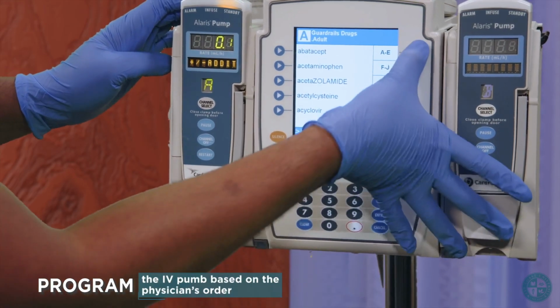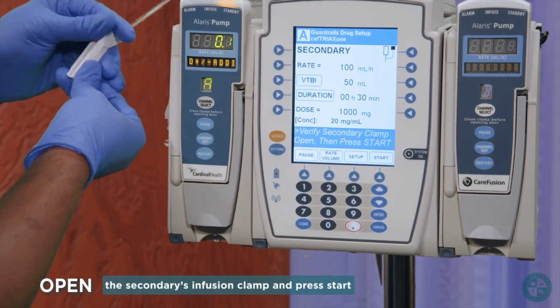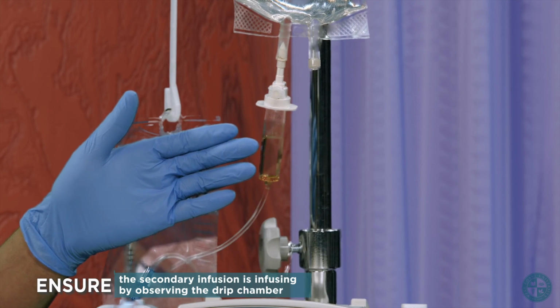Program the IV pump based on the physician's order. Open the secondary infusion's clamp and press Start. Ensure the secondary infusion is infusing by observing the drip chamber.